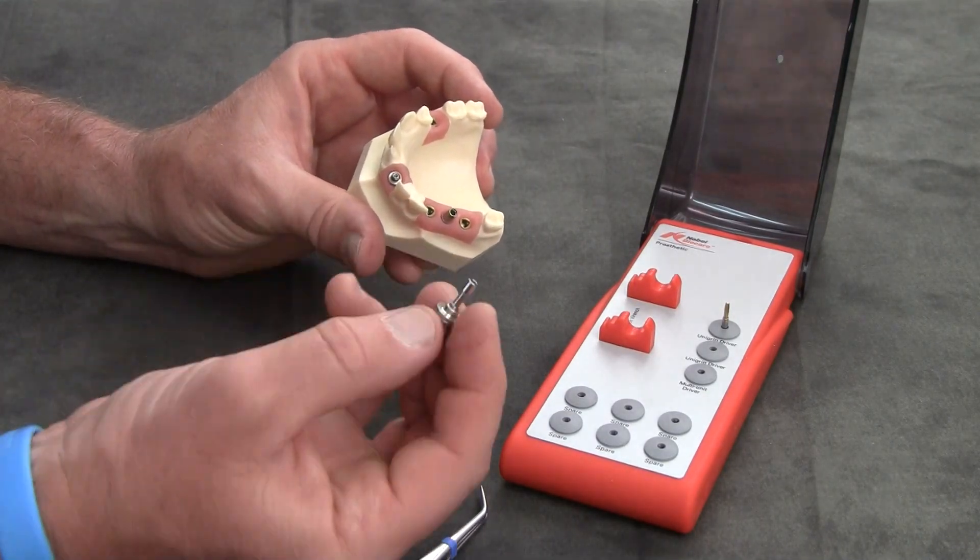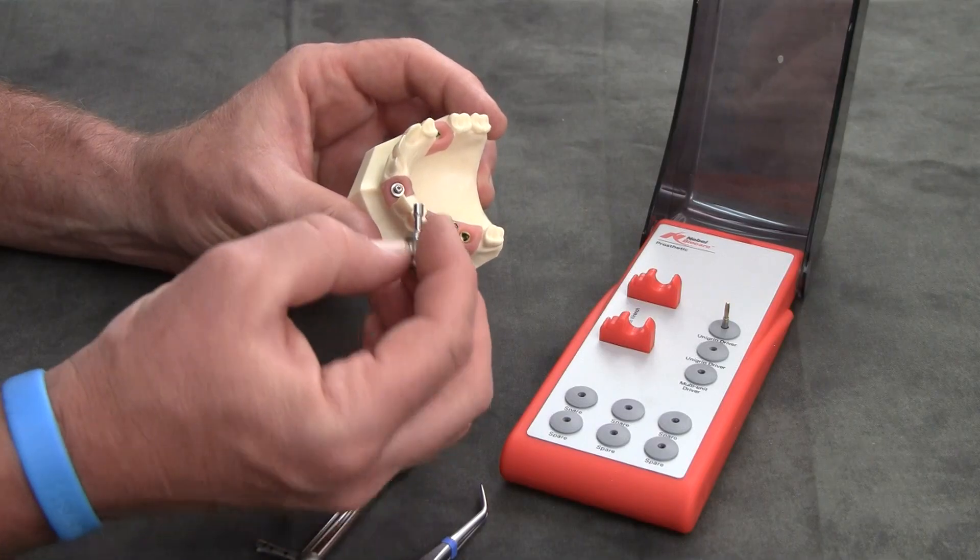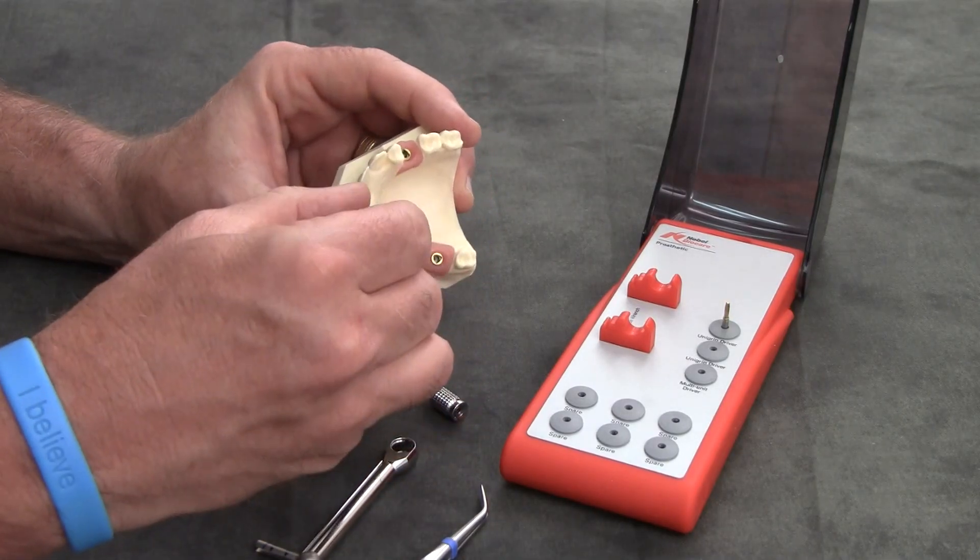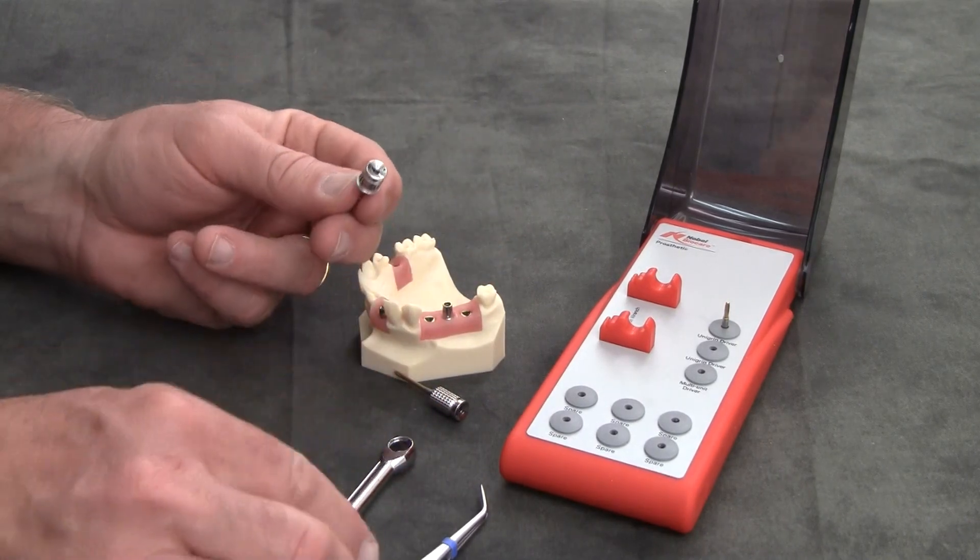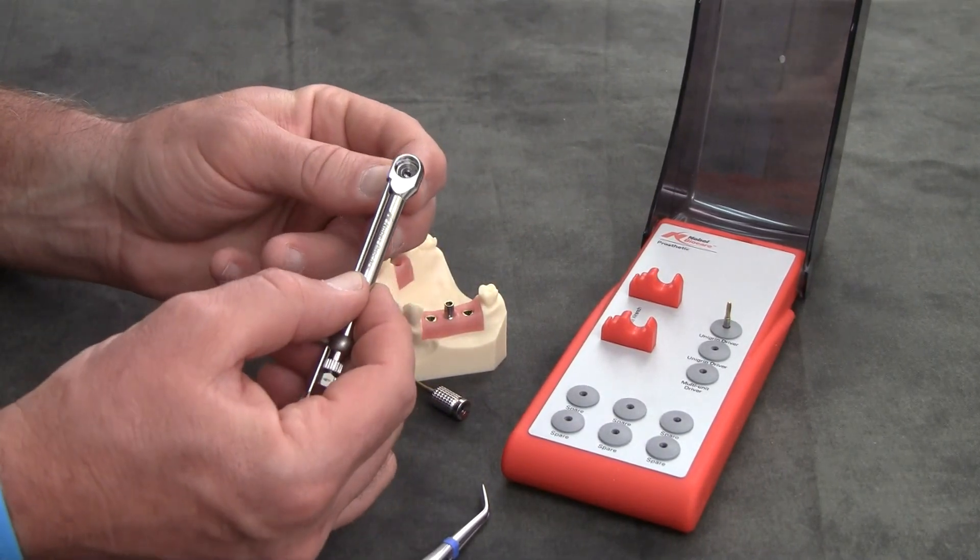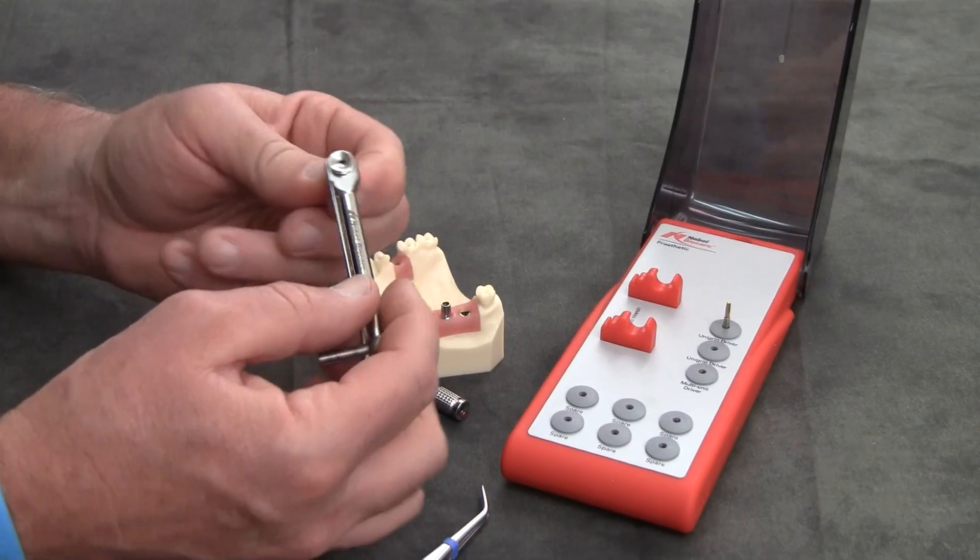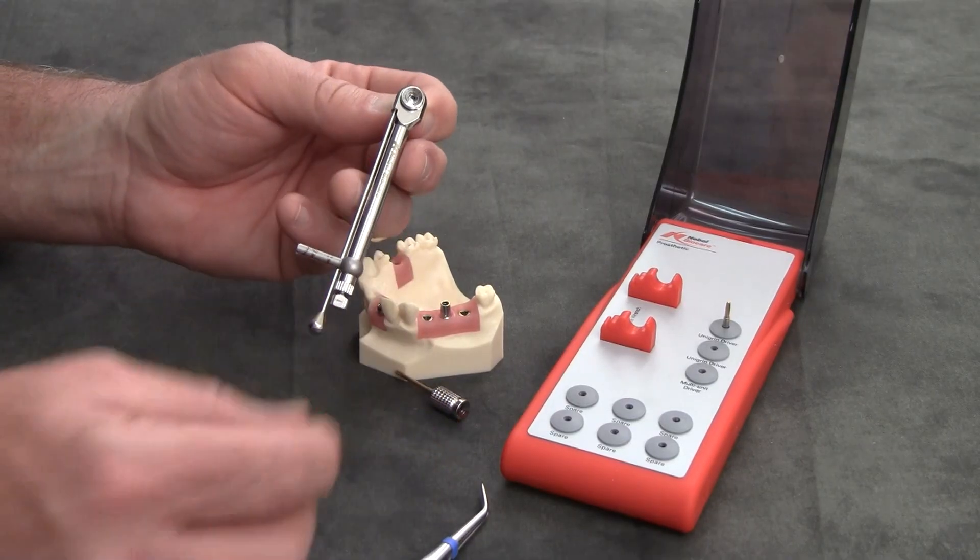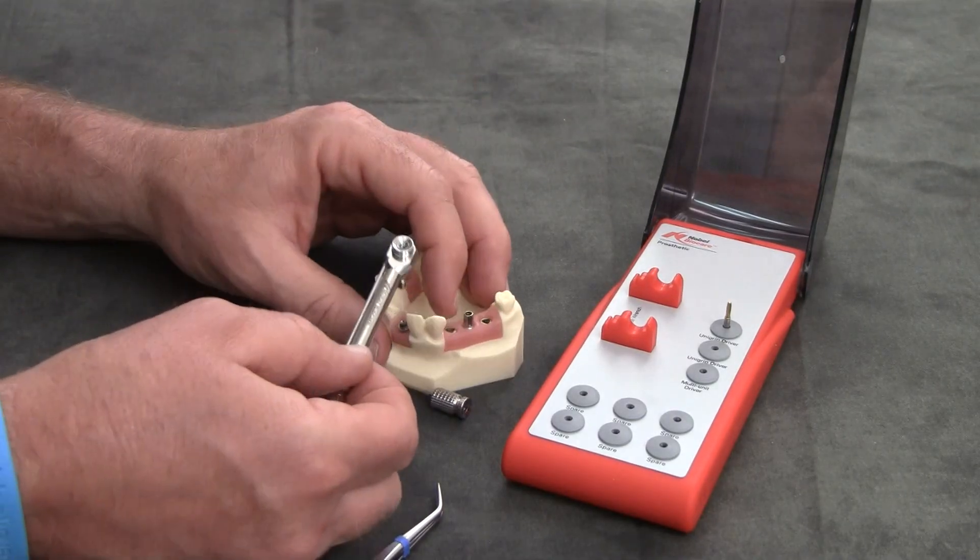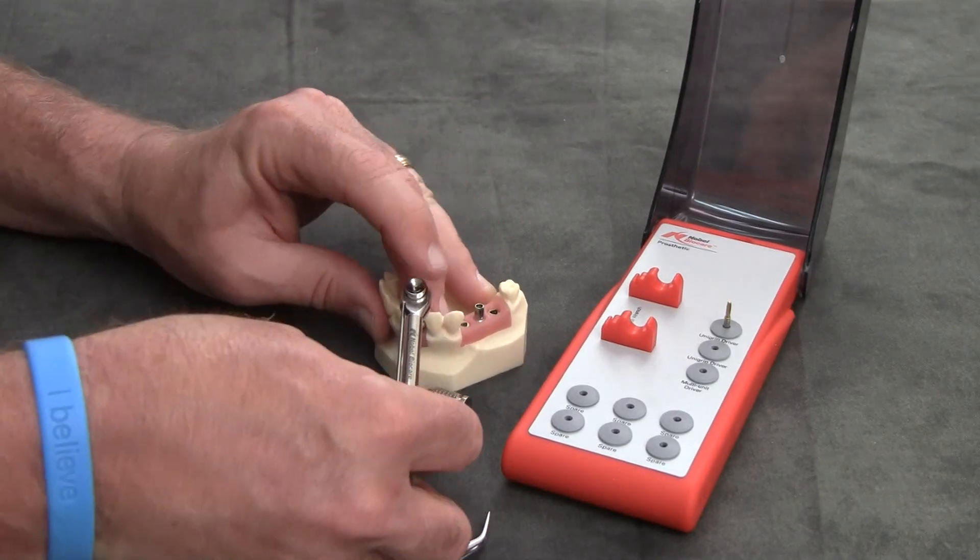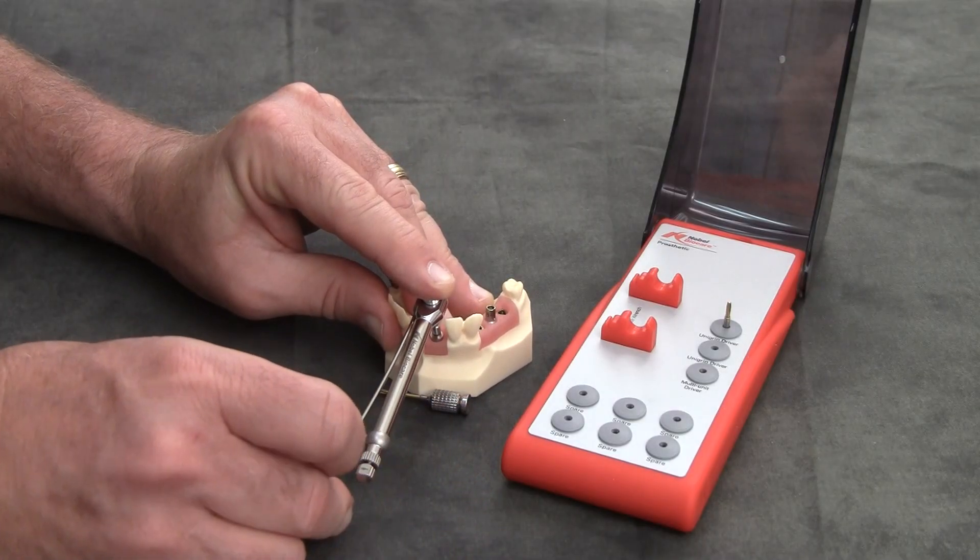And now you'll use the multi-unit driver and tighten as tightly as you can by hand. Now we'll use the torque wrench again, slipping it over until it hits the bottom, making sure that the directional arrow is toward us, take it to the abutment.